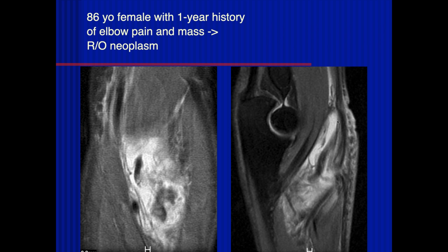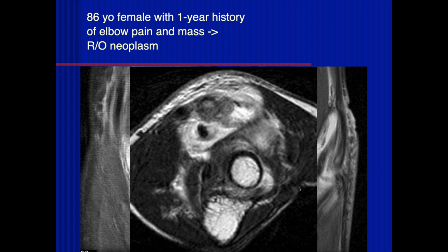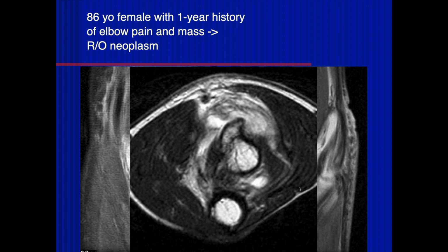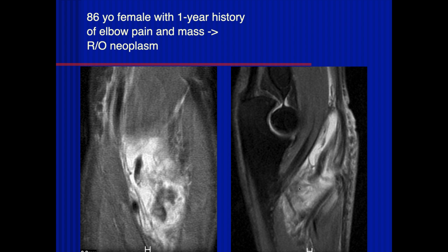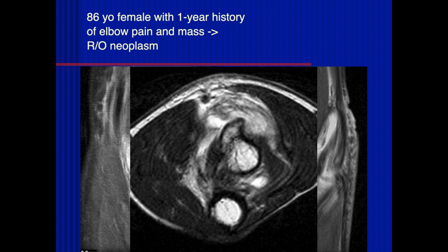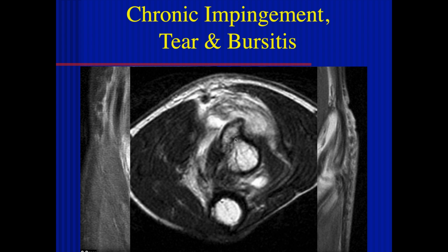So, 86 years old with a 1 year history of elbow pain and mass, rule out neoplasm. I see a retracted tendon with surrounding edema and fluid. I think this is a biceps tear. Yes. Okay, so here again we don't see a normal attachment of the biceps. There is some retraction of that biceps tendon and I can't see it attaching to the radius, and there's surrounding fluid and probably hemorrhage. It surprises me she's had this for 1 year, but she probably has some bicipital radial bursitis. So this is a patient who's got a big impingement here and severe bursitis, secondary to the chronic impingement and tearing of the distal biceps. Right.